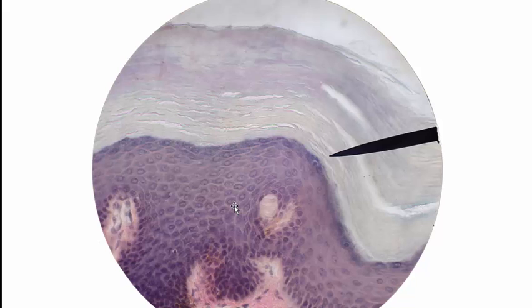Another thing I could mention since we're here, can you see that there's a little bit of a darker shading down here in the stratum basal or stratum germinativum? The reason for that is there are melanocytes down here. Melanocytes make the pigment molecules that give us our skin color. The melanocytes make melanin, which is the color molecule or pigment molecule for skin and hair, and the melanin is transferred to the other keratinocytes, so the keratinocytes will have some of the pigment as well.